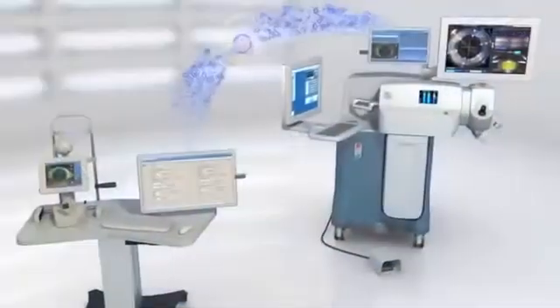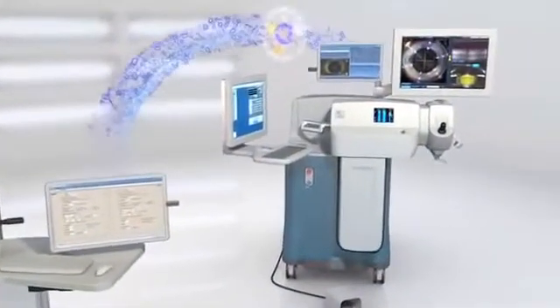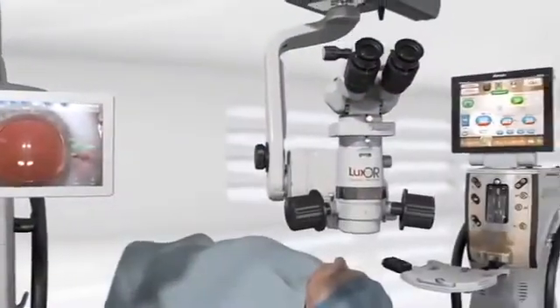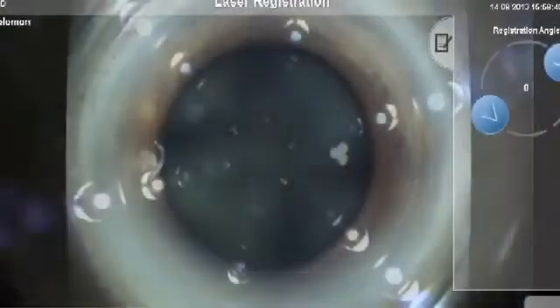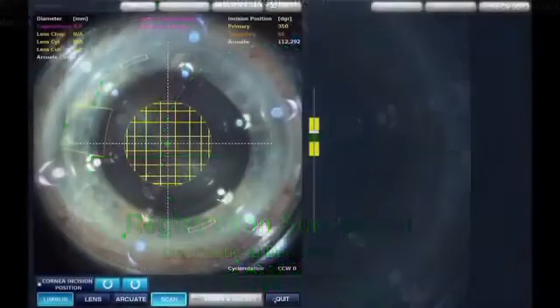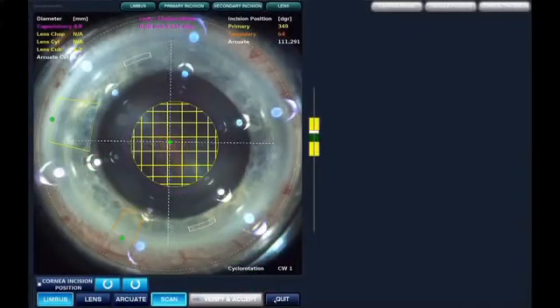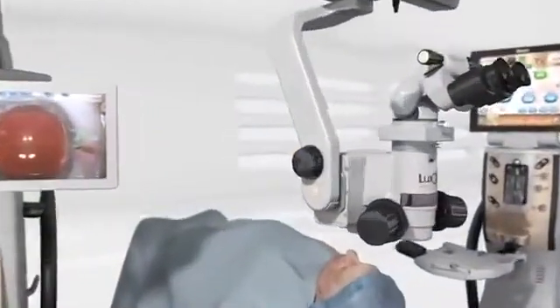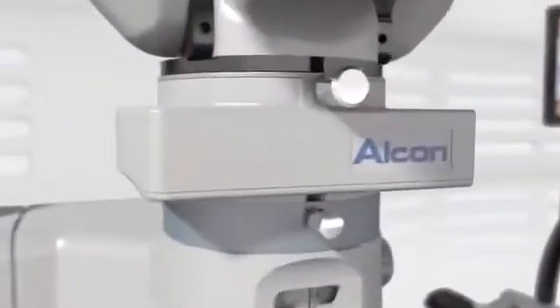The Verion Digital Marker can be used with the LenSx laser and with most surgical microscopes. With the LenSx laser, the Digital Marker facilitates pre-population of the patient parameters as well as pre-positioning of the surgical incision overlays. Working in concert with a Microscope Integrated Display, or MID, the Verion Digital Marker also provides real-time tracking overlays through the optics of a surgical microscope.